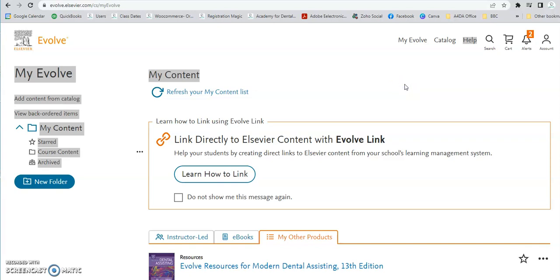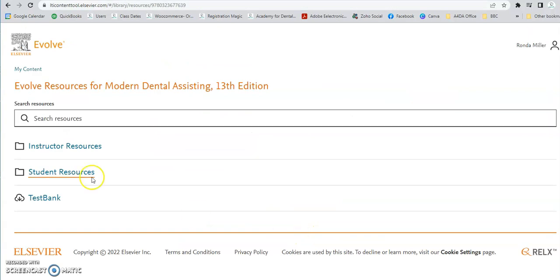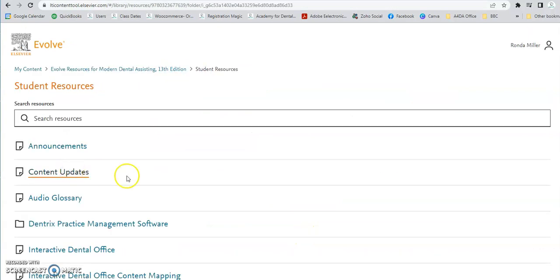To access your Evolve.com interactive dental office assignments, whether it be digital charting or mounting an FMX, you will log into your Evolve account that you set up at the beginning of the course. The directions are in the introduction section as well as the inside cover of your textbook. Log into your account, go to My Evolve, and you will have the Evolve resources sitting there. Select that, then select Student Resources.